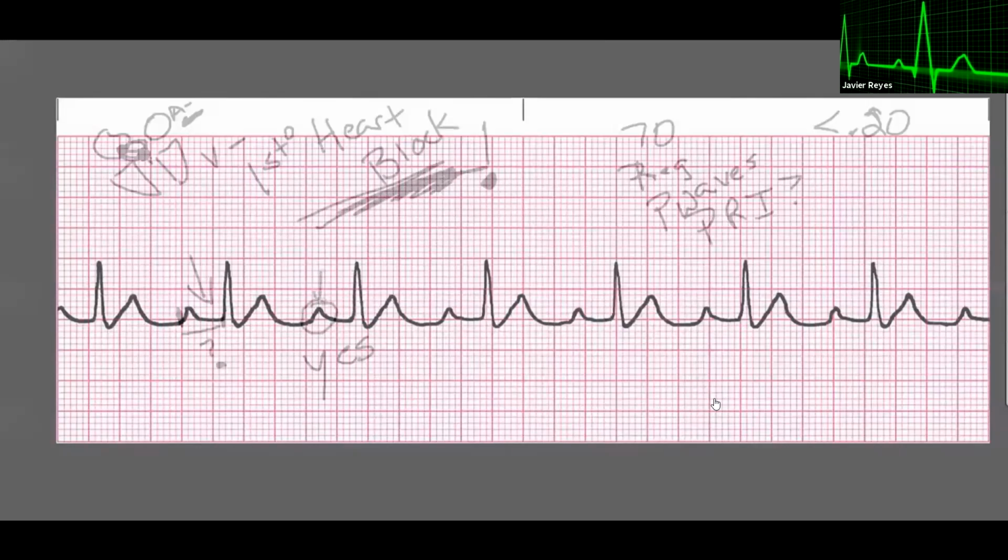We still have a P wave, right? We know that to be a fact because you can't have a PR interval that's extended if you don't have a P wave. So you've got a P wave, you've got your QRS, and you know the QRS is within normal limits. You're looking at this, and this is a sinus rhythm because we said the rate was 70, right? And the P wave is in charge. So this is the only rhythm in the heart blocks that you would give a first name. So it's sinus rhythm with, that's the little signal for with, a first degree heart block.